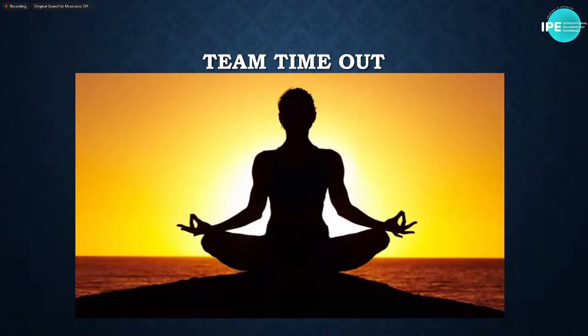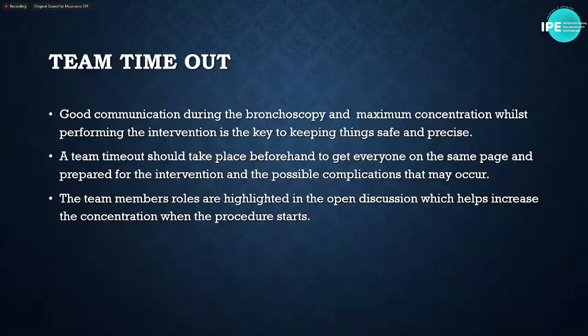And the last thing I want to talk about is something that I hold very, very dear, and that's the team timeout. I can't overstate this enough, that's one of the most important parts of practicing bronchoscopy. Good communication during the bronchoscopy and maximum concentration is the key to having a safe and precise procedure. A team timeout should always take place beforehand, where everyone understands what we're going to do, and it should be very loud and clear communication.